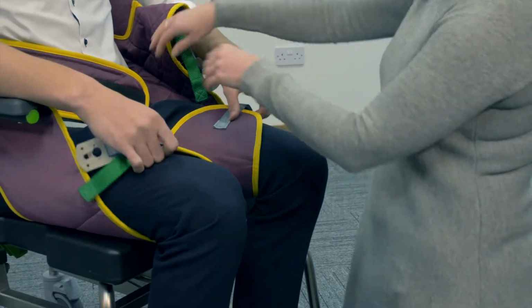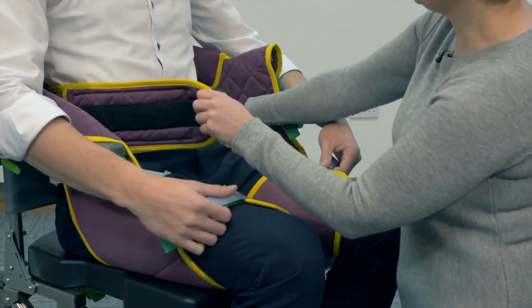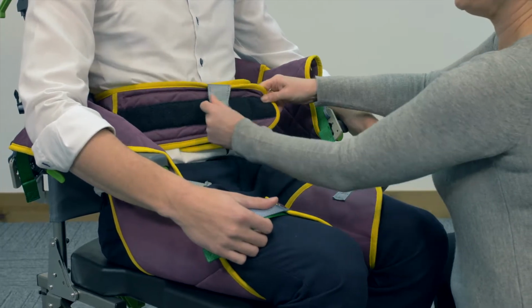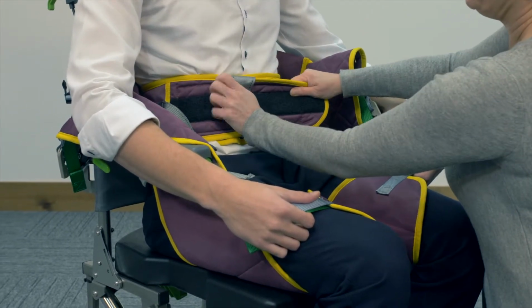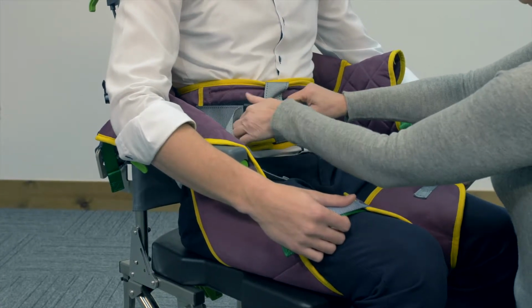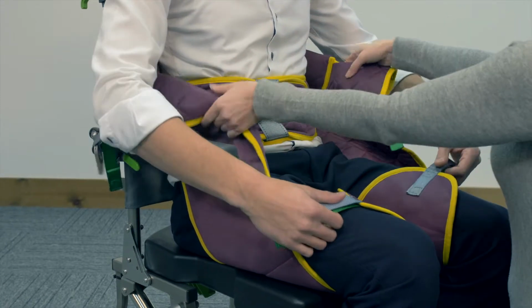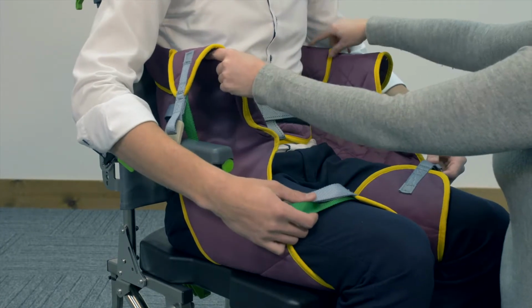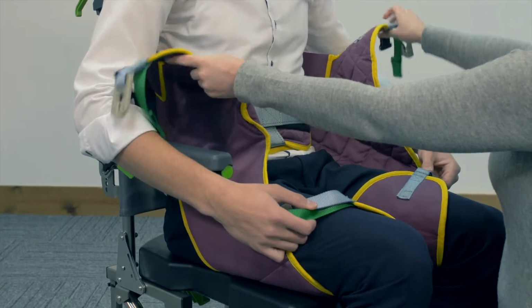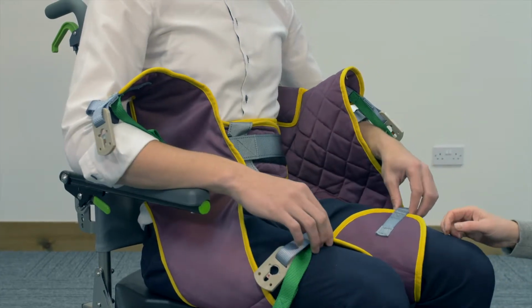To make sure you've got the right size of sling, you need to check that the Velcro strap will fit around the trunk snugly, and the belt needs to also fit snugly. You also need to check that the spongy supports under the armpits come forward from the armpits to give enough support before using the sling to hoist.